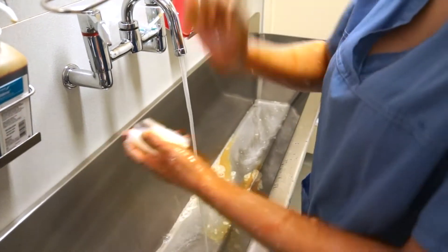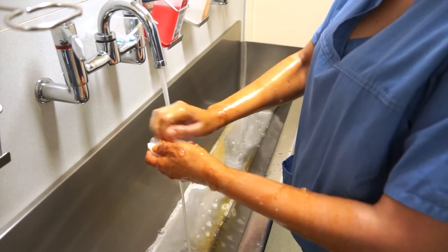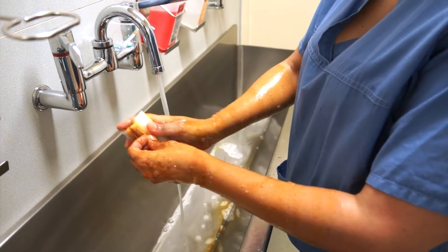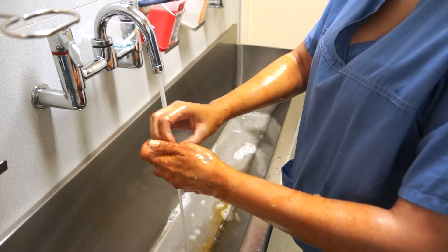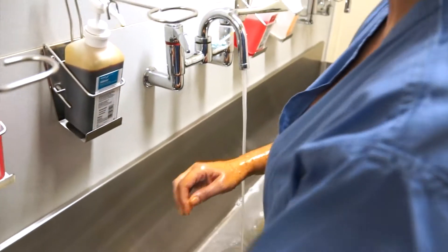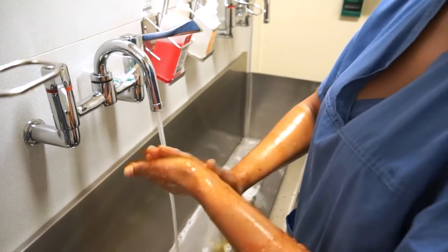Using your elbow again and applying that to the nail brush. I'll give my nails a good scrub, make sure they're all clean. Discard that into the bin. How long should you do that for? Just until they're clean.